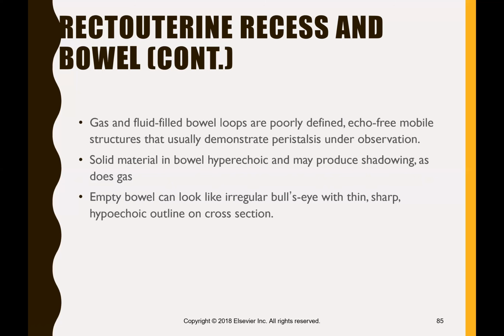And sometimes if I'm having trouble distinguishing between a mass and bowel, I will watch to see if the bowel moves or the contents in the bowel move. If I see that, I'm very aware that that's just bowel and it is not some kind of crazy ovarian mass.